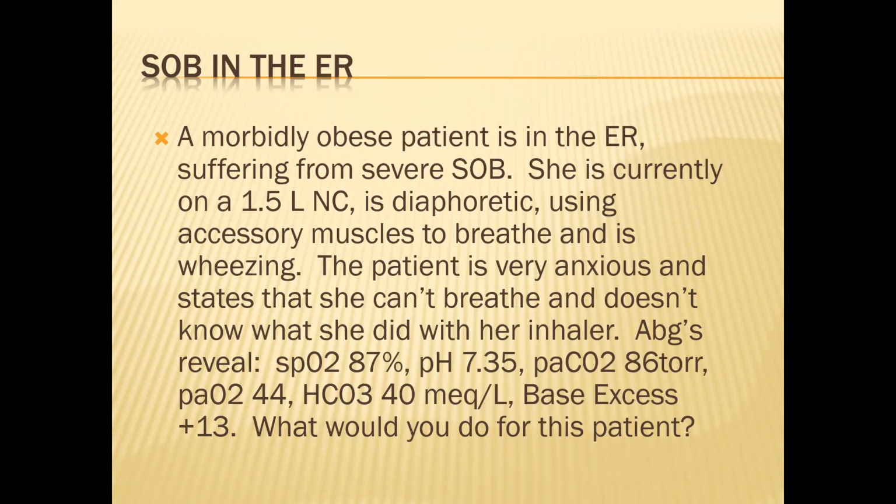Yeah. How high can you go on a Venturi mask before you have to switch over to 50%? So yeah, you're probably by 50%, you're giving enough oxygen. You start at 24, have all your adapters there. Start switching them. 24, 28, then what does it go to? 35 after? 35, 40, and then 50, right?